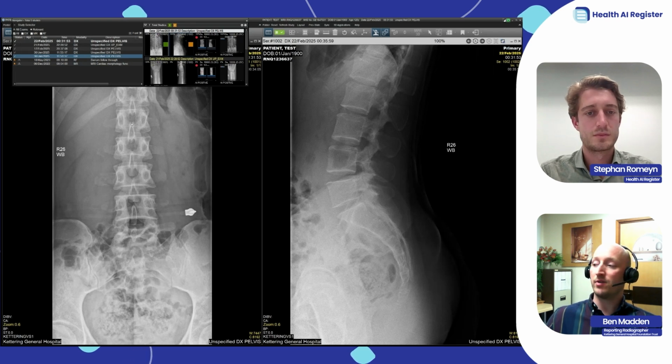But any x-rays that are missed, and there seems to be a trend in it missing fractures, for example, lateral hips can be a problem depending on condition of the x-ray, we then report that back to RB, and they always have a solution, be it short or medium term, to work on to improve that accuracy. And there's things we can do as well, especially if it's projectional or exposure wise or something like that.